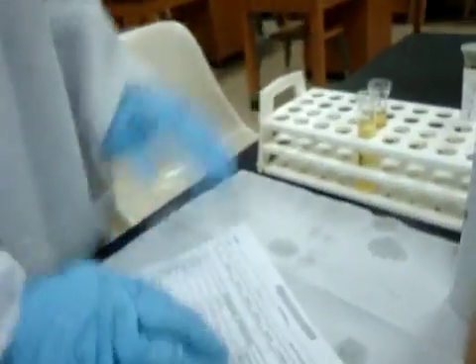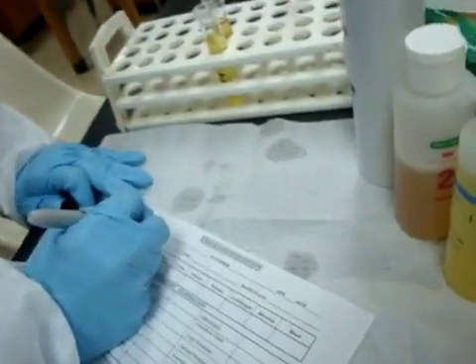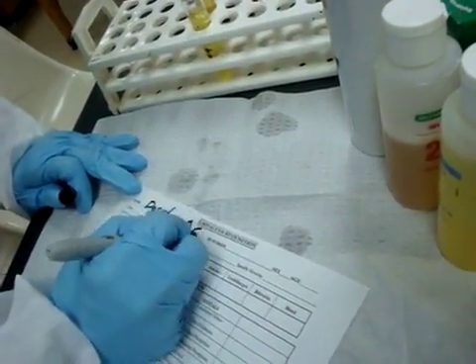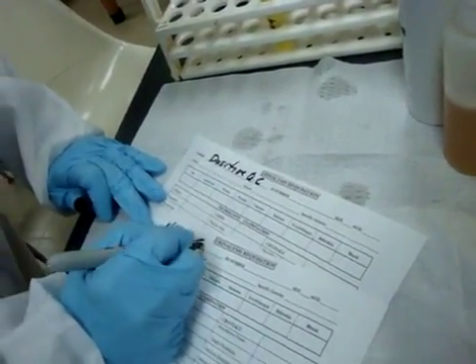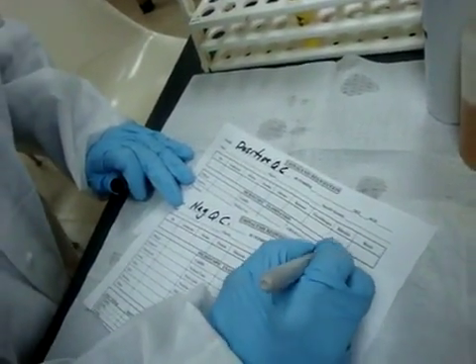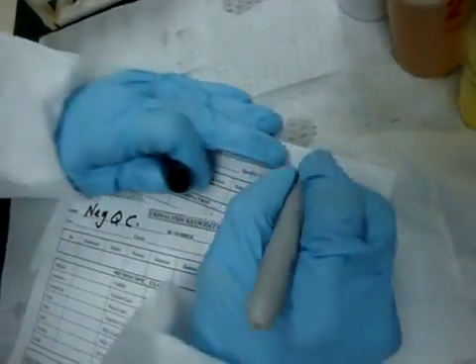I'm going to get my urine requisition, and I will write on the first one, positive QC, and on the second one, negative QC. I will put the date up here, and today is 10/15/09.